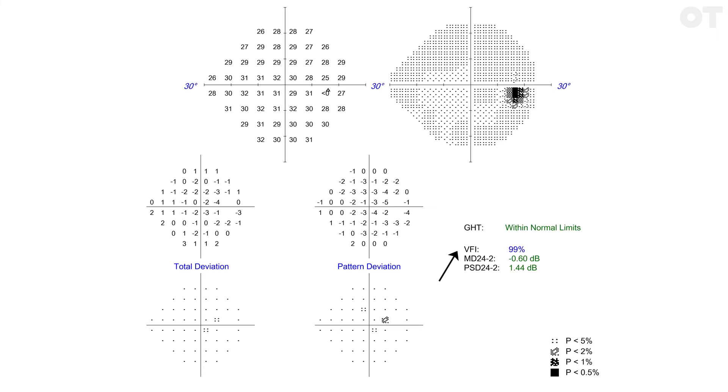VFI or visual field index is found on newer machines and is intended to be used as an indicator for comparison over time. Around 100% indicates normality, whereas 0% indicates complete loss of measurable visual field. It uses the total deviation values to calculate a center-weighted mean deviation and represents central ganglion cell loss.